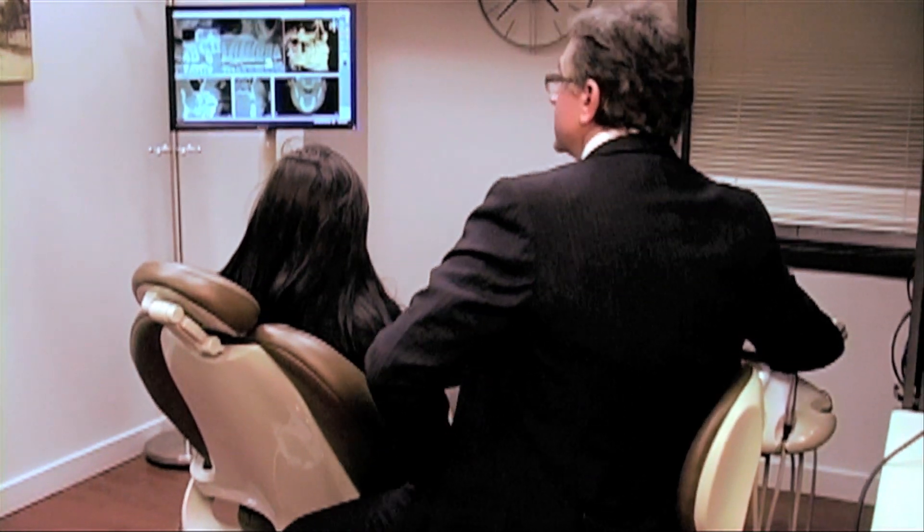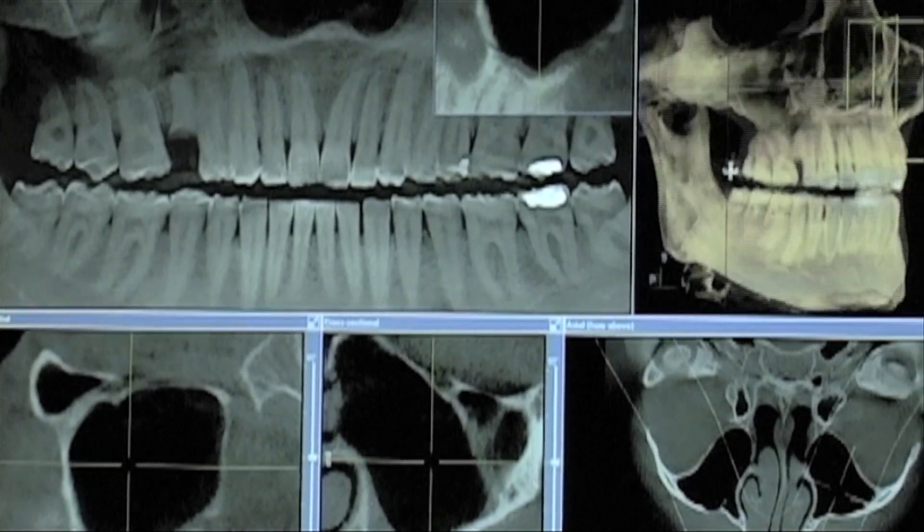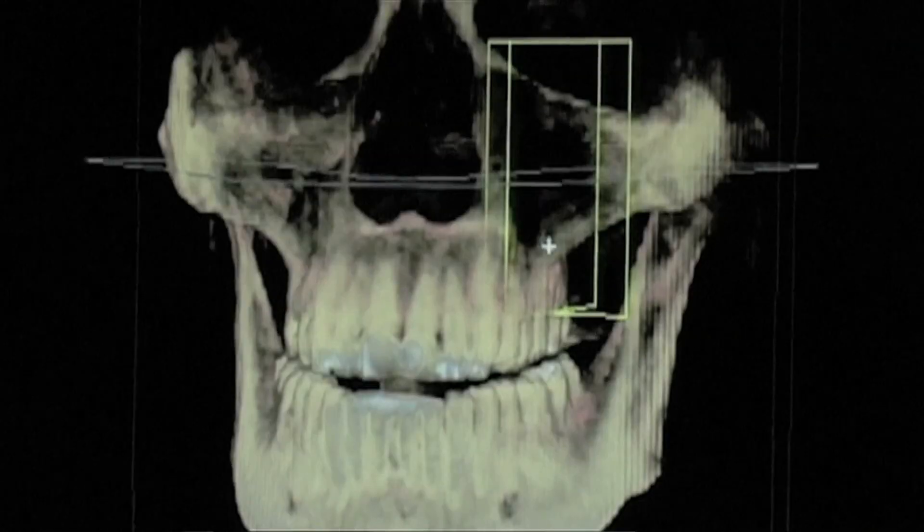Now we have five images. As a result of the 360-degree image that we just took, we can now look at the whole anatomy of the patient from every angle.